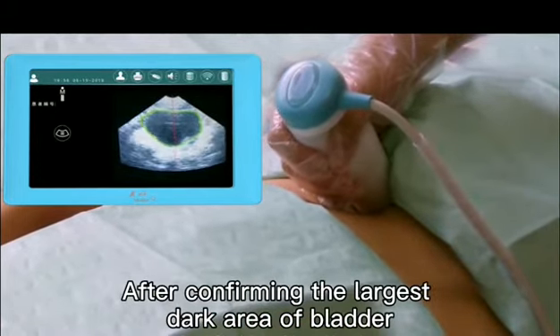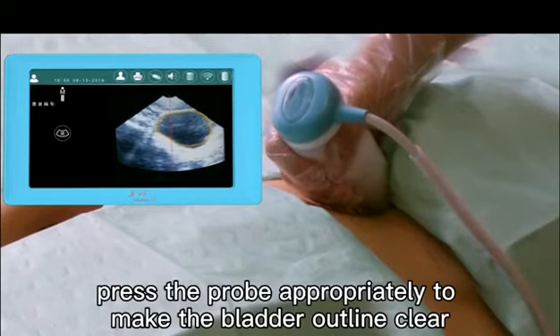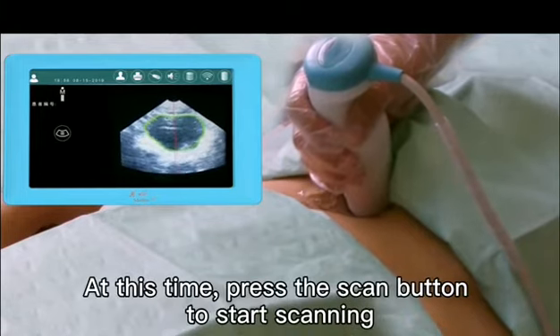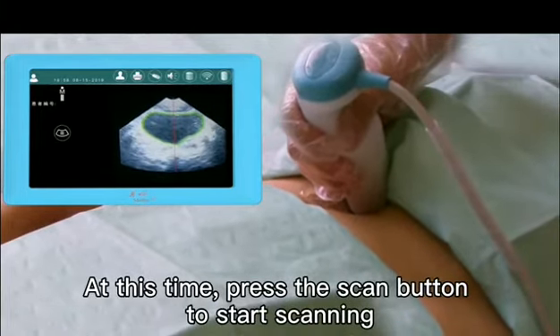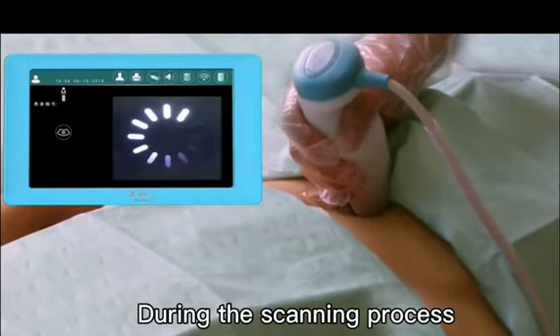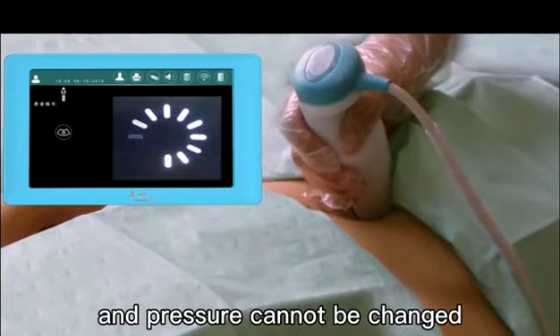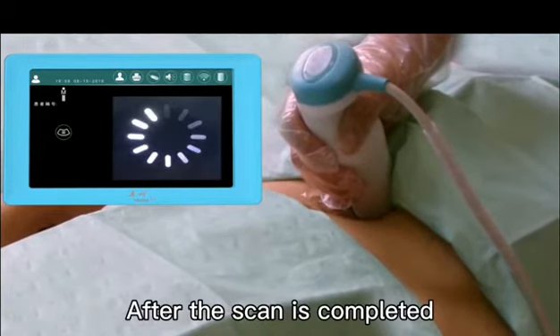After confirming the largest dark area of the bladder, press the probe appropriately to make the bladder outline clear. Then press the scan button to start scanning. During the scanning process, the probe angle, position, and pressure cannot be changed.